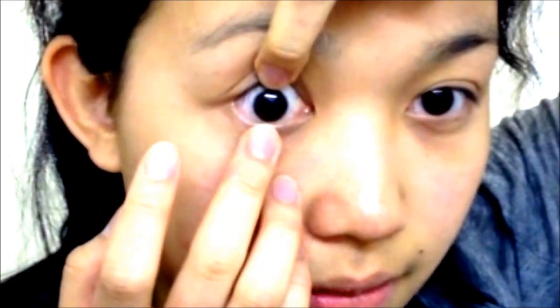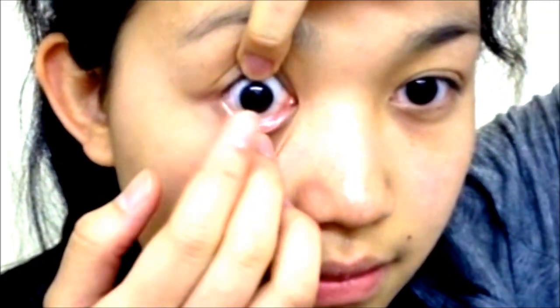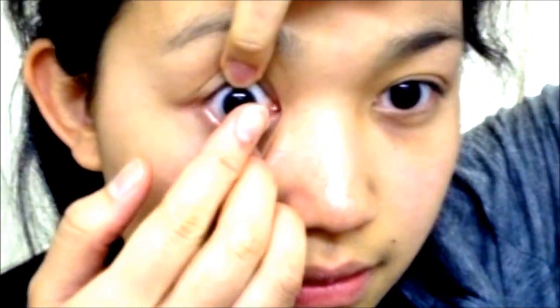Should the lens be uncomfortable on insertion, simply move it slightly off centre with a clean finger, and as it returns to position, it will be more comfortable.